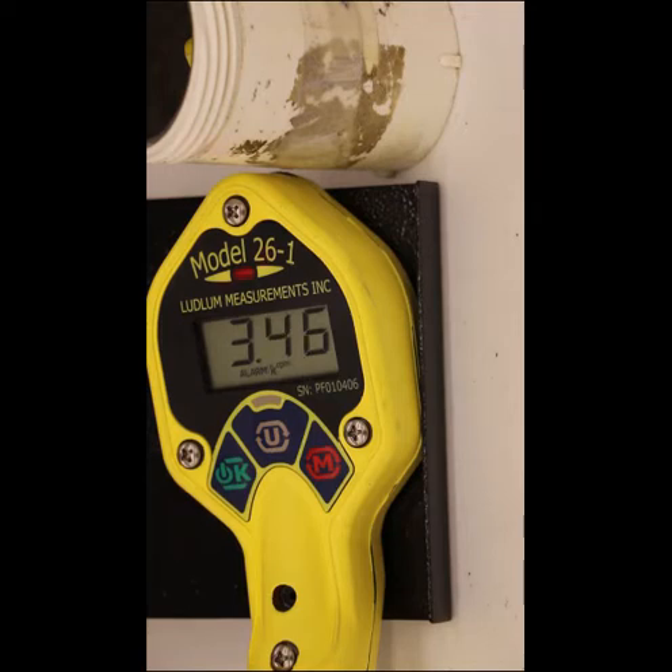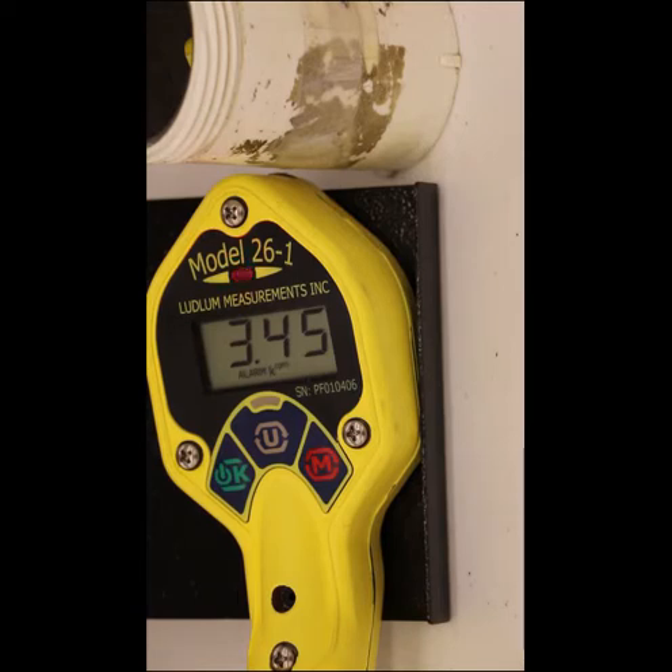Under a non-alarm condition, pressing the OK button will turn the click audio on and off. If an alarm condition is present, pressing the OK button will acknowledge the alarm and turn off the audio. The alarm display indicator will remain on and the alarm status LED will be flashing.